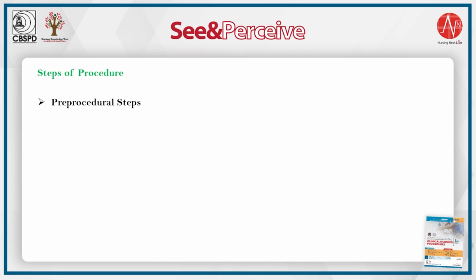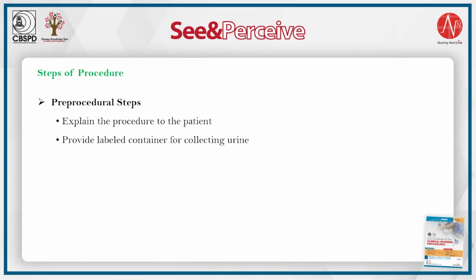Pre-procedural steps. Explain the procedure to the patient. Provide labeled container for collecting urine.